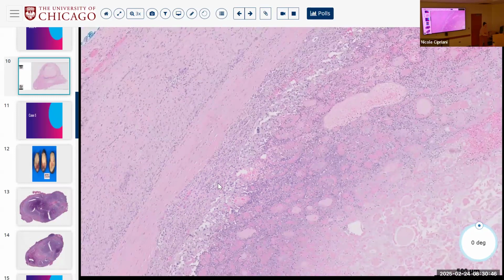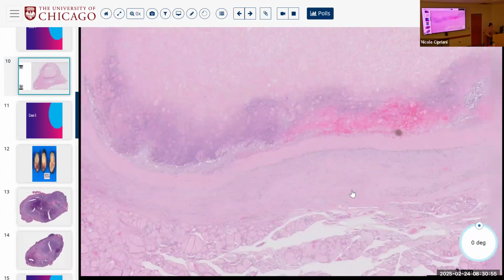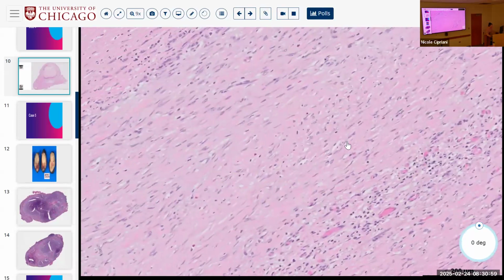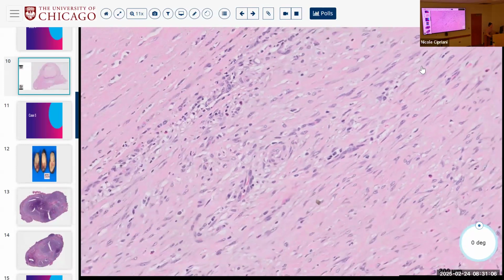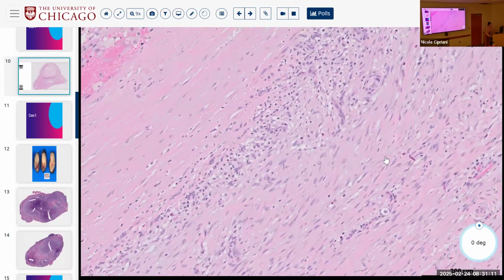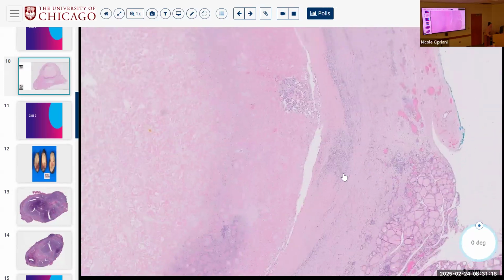Thank you. Last question. Is it invasive? At low power, I didn't really see it, but I was looking at some of this and I just thought it was hard to tell. There were some vessels where I'm like, I don't know what is going on. It's tough because I think there's a lot of stroma, reactive stuff happening, but possibly it wasn't super clear to me though. Wasn't super clear. Okay, thank you.